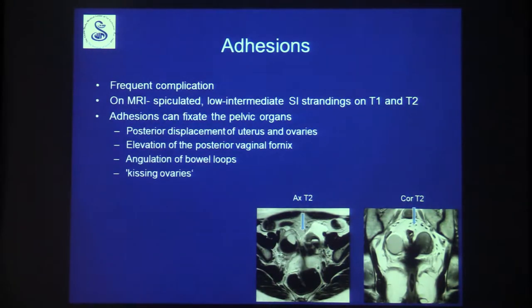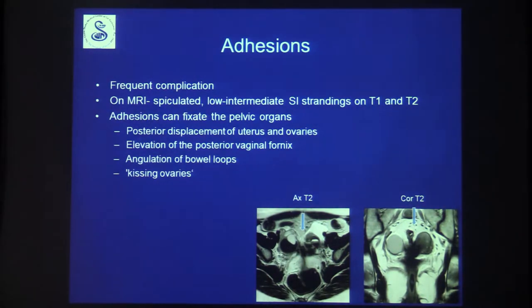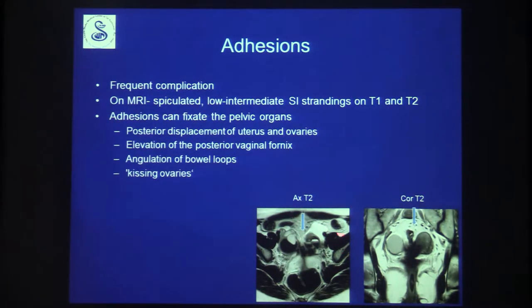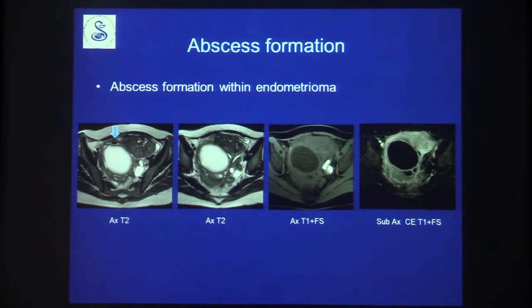Adhesions are a frequent complication, appearing on MRI as spiculated low-to-intermediate signal intensity strandings on both T1 and T2. They fixate pelvic organs, causing posterior displacement of the uterus and ovaries, elevation of the posterior fornix, angulation of bowel loops, and kissing ovaries. Two ovaries with endometriomas can be seen kissing together with adhesions. Another complication is abscess formation within an endometrioma, with gas visible inside on coronal images.